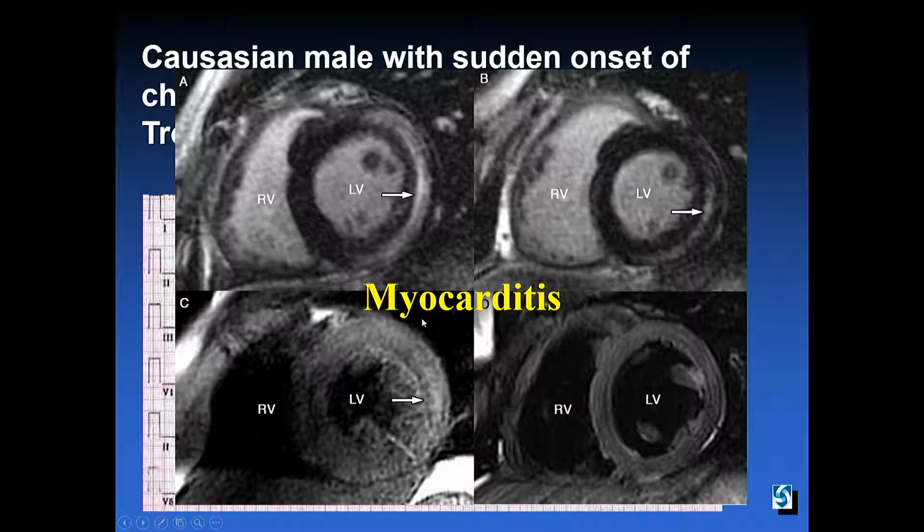a markedly large area of acute inflammation and some scarring. The acute inflammation is matched by the bottom picture, the T2 weighted picture, that shows there's extensive T2 edematous tissue. And you can see how thick the myocardium is, indicating that the whole heart is inflamed, but most specifically in the lateral wall, the epicardial part. Now, this sort of change is classic of viral myocarditis, and many have implicated this lateral wall involvement to be associated with certain types of viral etiology, like B19 or parvovirus, which is exactly what he turned out to be. The virology, of course, is not available until many weeks later.